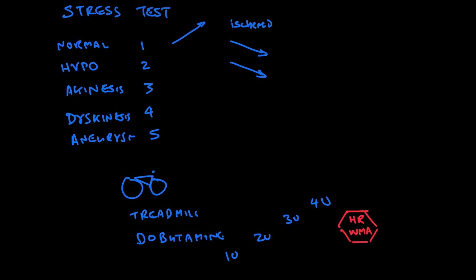Now, what if we see that it is not moving much before or after? Or what if we see that it is akinetic before stress or with stress? This is something that's already dead, an infarction. Dead tissue will not get better with stress.